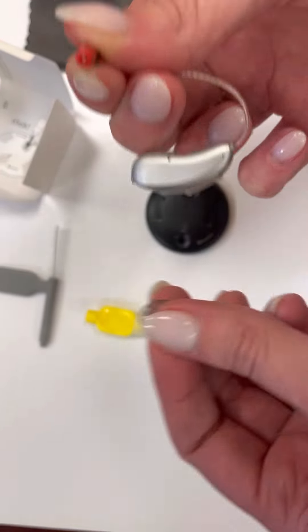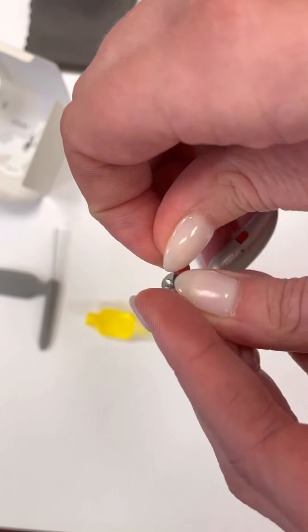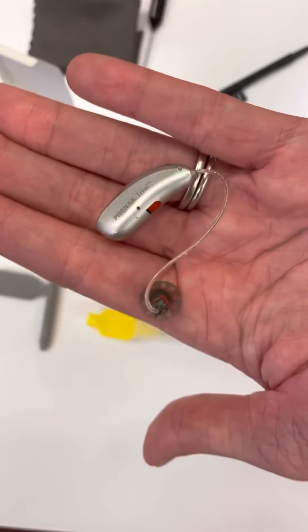And then all you have to do is reattach the dome. Now you're ready to wear.